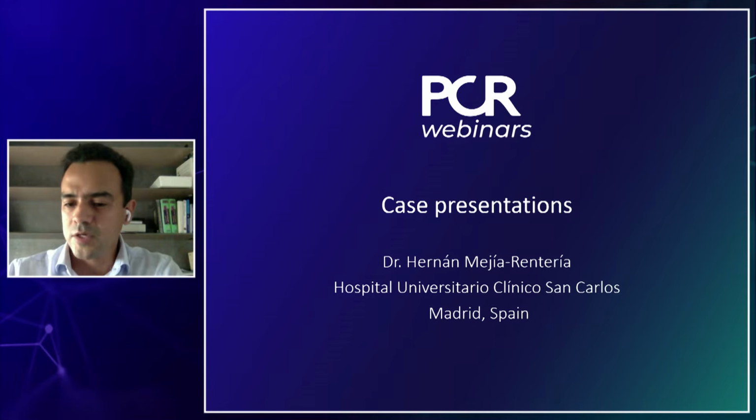Thank you very much. So perhaps we can see a clinical case, because we have answered the principal question of the audience. So perhaps, Anand, you can show us a clinical case. Okay, sure, thank you.